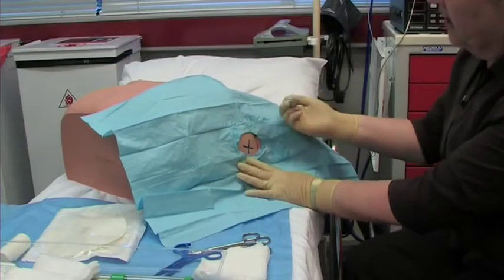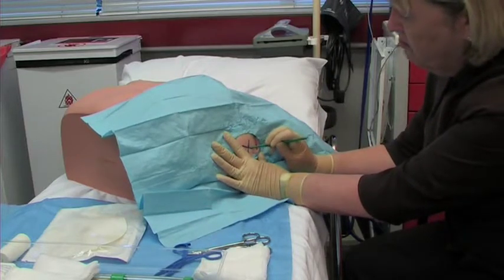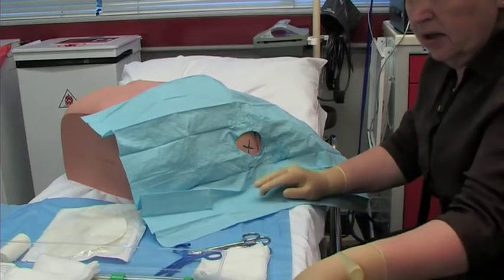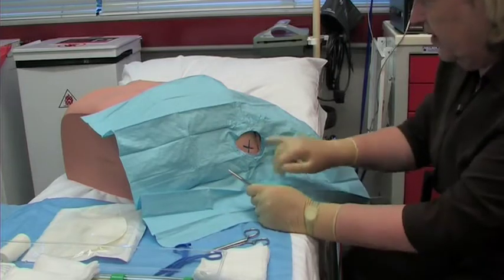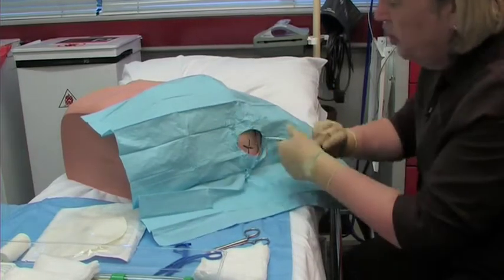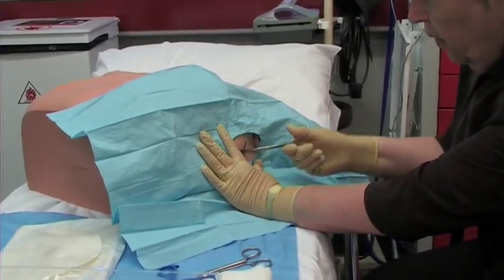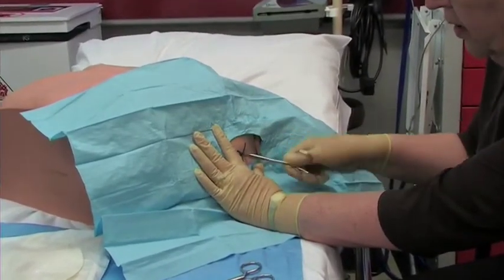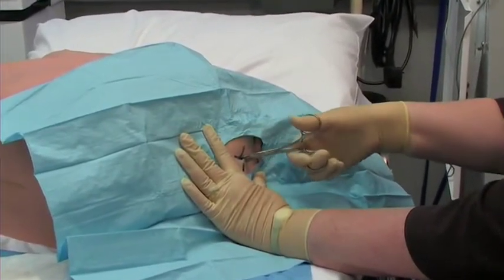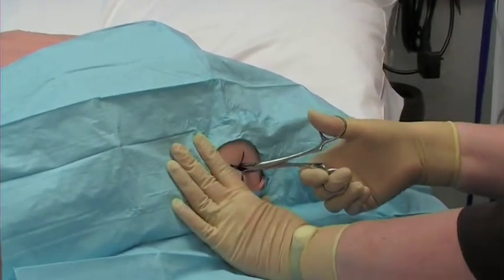Having draped the area, our next step is to take the scalpel and make an incision, perhaps an inch or so. We now need to extend this incision through the muscle down to the rib. Two ways of doing it: one is to use forceps, pop them into the area and just open and close them several times — that actually allows you to force open the muscle fibres.